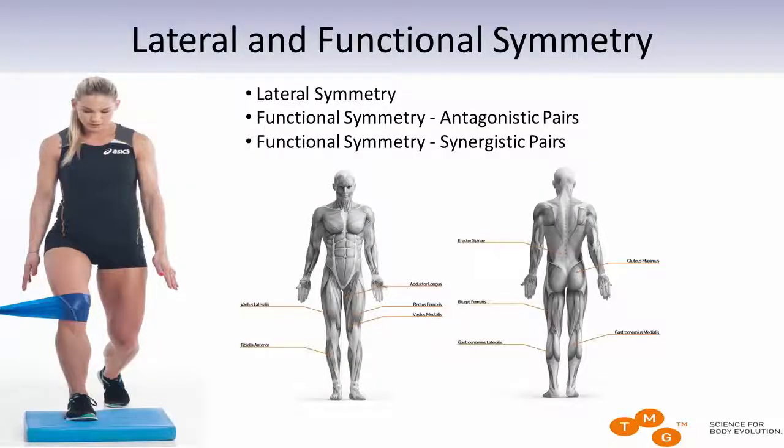In most cases, the symmetries listed here will also be calculated and displayed. It is much less important to compare your values to the reference values than to compare the muscles within your own body. So obviously you will always compare left and right side, especially on the muscles which are involved in running in that case. So the lateral symmetry will always be calculated.